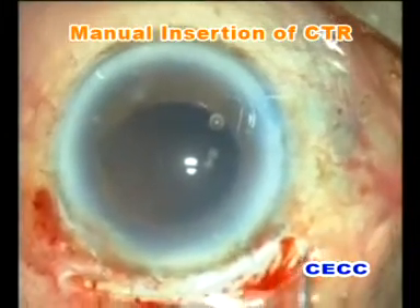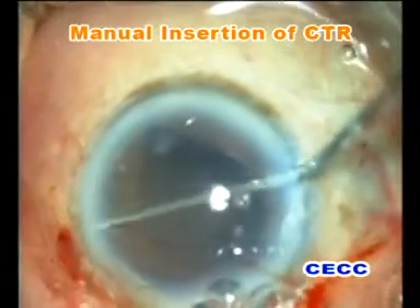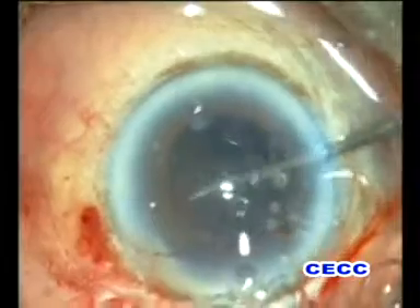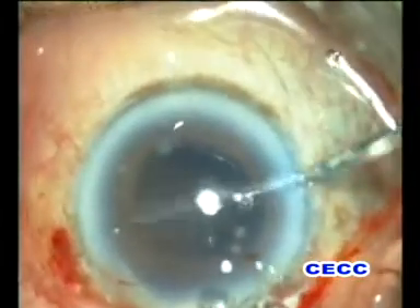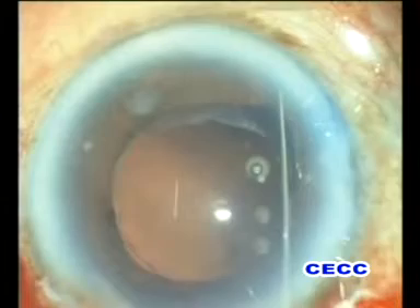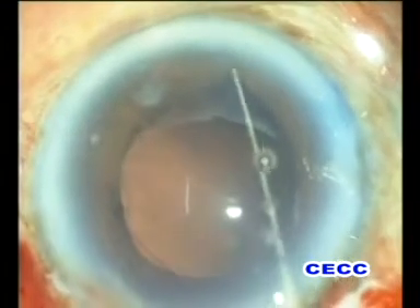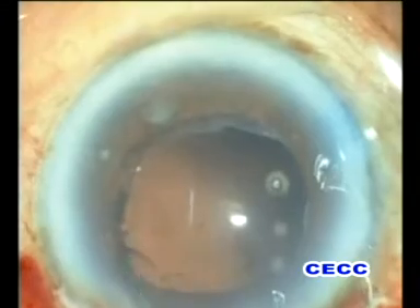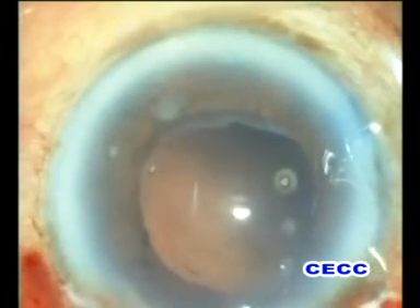A capsule tension ring is inserted into the capsular bag to reposition the capsular fornices in the area of zonular dialysis. After the insertion of the ring, the rhexis appears well-centered. The capsular bag is inflated with viscoelastic and the anterior chamber also deepened.